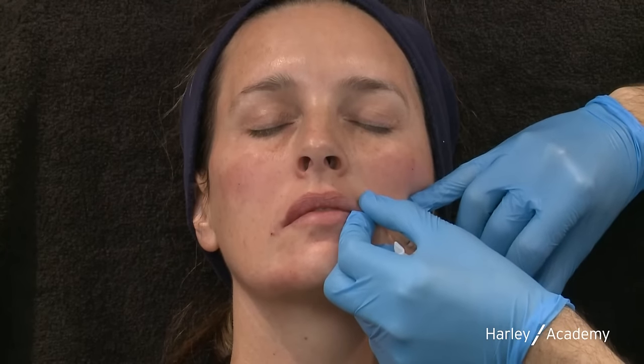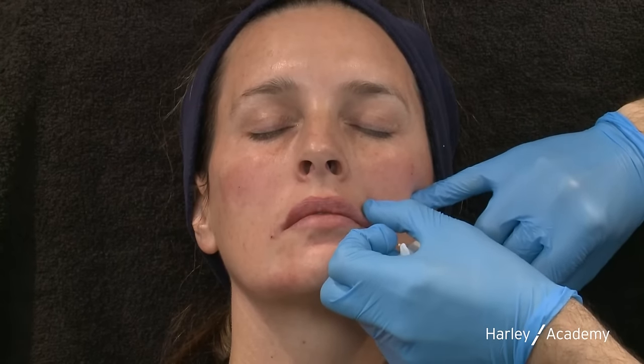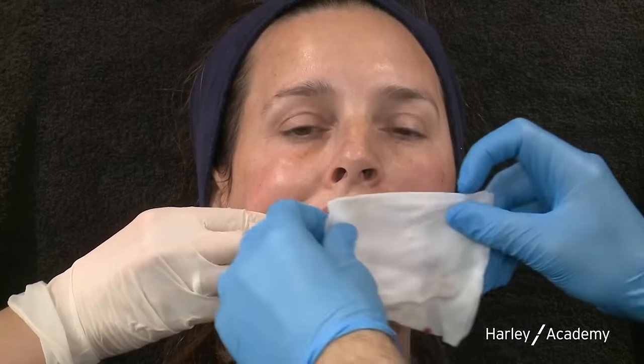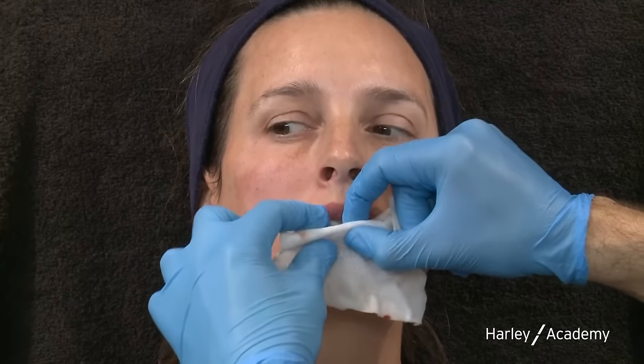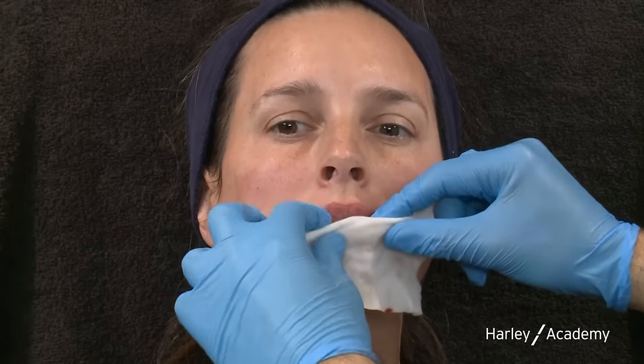If your glove ever goes into the oral cavity, stop and change gloves. The finishing touch is massage — I roll the lower lip to create some convexity. I've used a total of 0.5ml in the lips. Overall we've used a total of six mils of filler across this full face treatment, and it's important to say that I would not have achieved this result without the sequence approach — treating the scaffolding first before the lips.